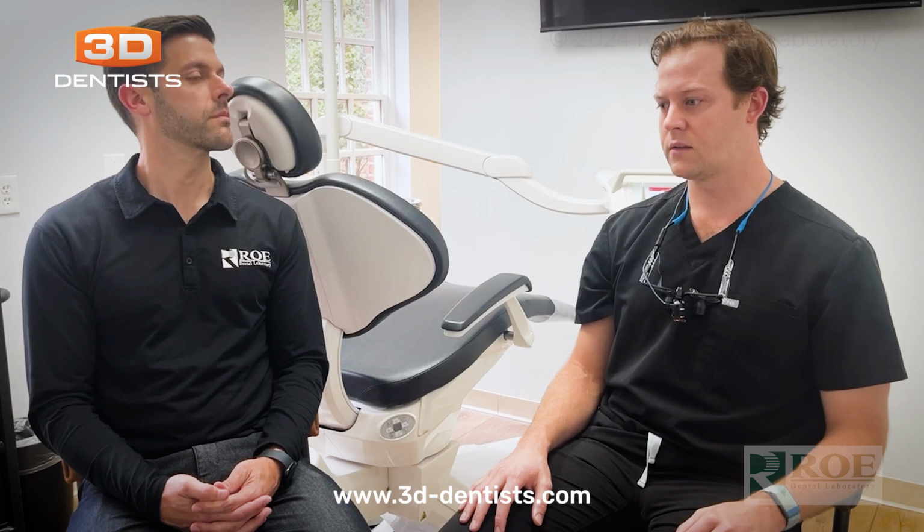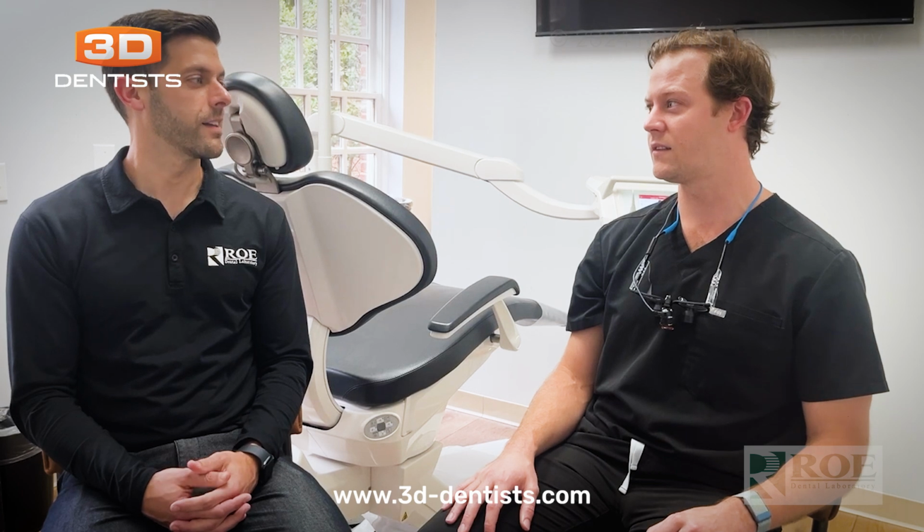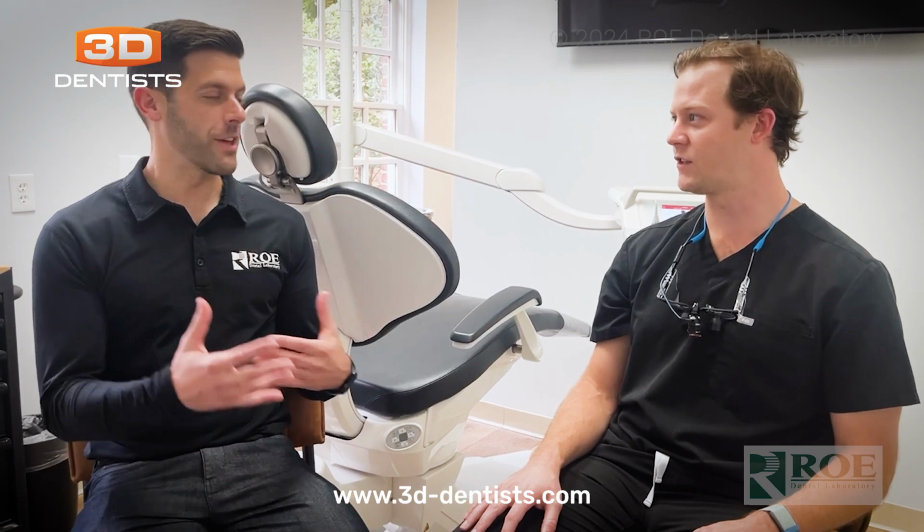We ended up placing 4 implants and converting our patient into a locator fixed option, which was pretty cool to be able to see that. That's really cool. So the patient actually left with the fixed prosthesis. And you were one of the lucky ones because the others didn't get that option. So that's kind of cool to see that workflow.